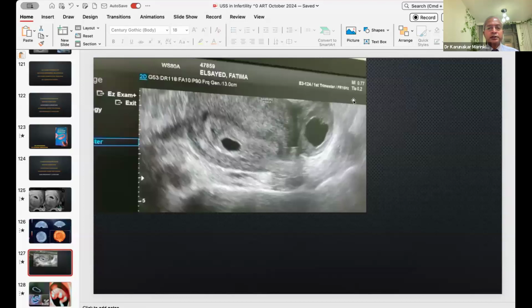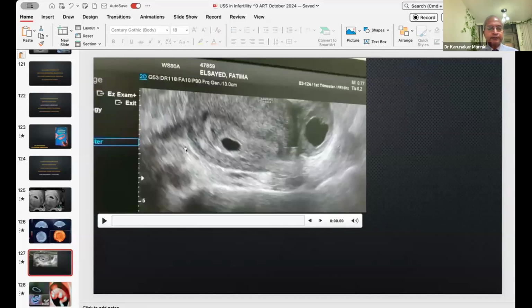Can somebody mute her? Sometimes you see heterotopic pregnancy, but you need to have an index of suspicion.